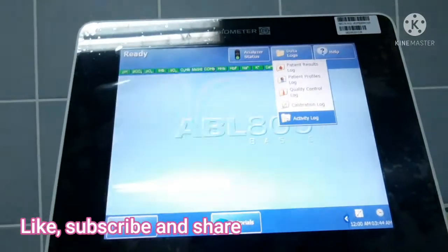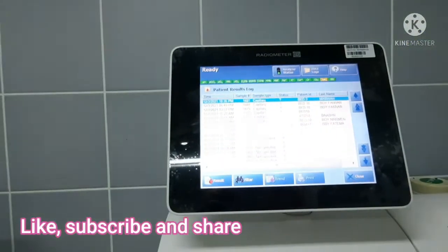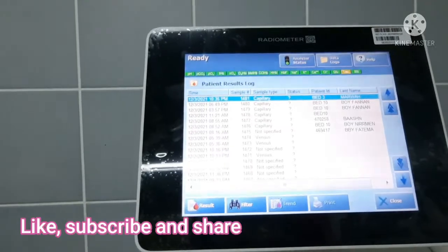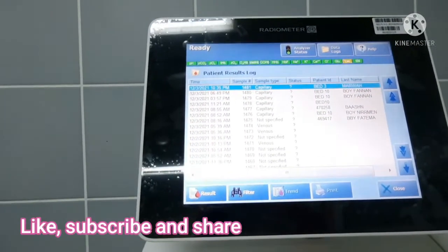And all the data, you can check here all the data of the patient. If you misplace any result, you can go in the data logs and you can print it again.